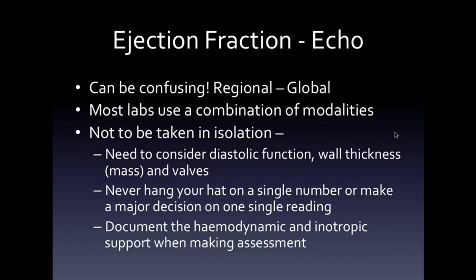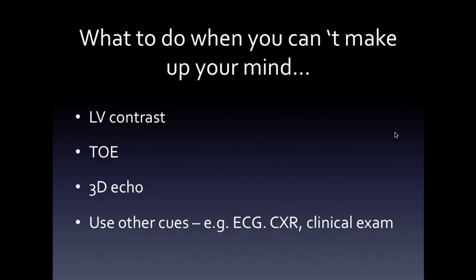Now, there's many times when being as cautious as you can, taking everything into account, you still can't make up your mind. And there are tricks which, I'm not sure how many people use LV contrast.